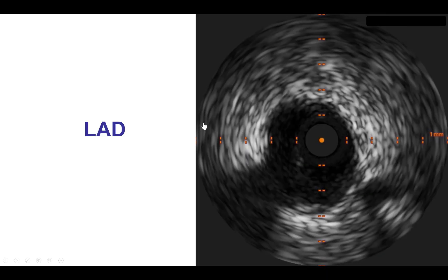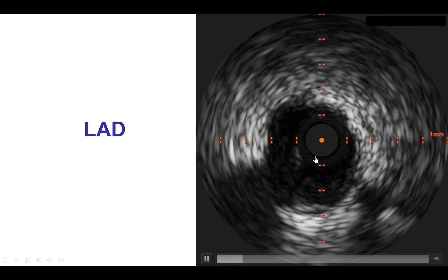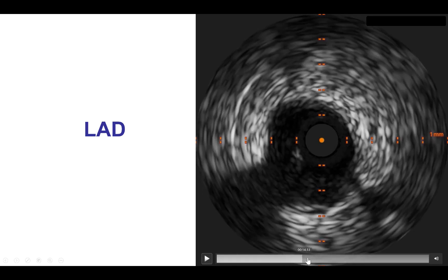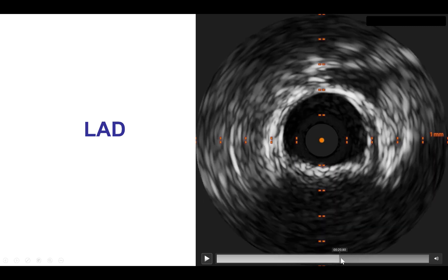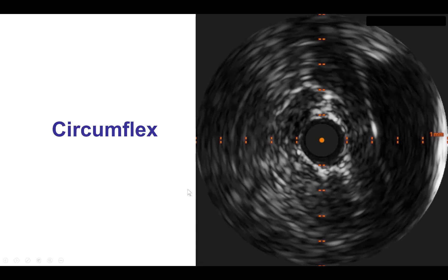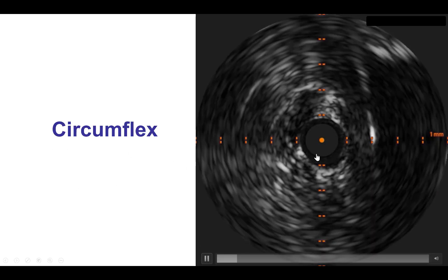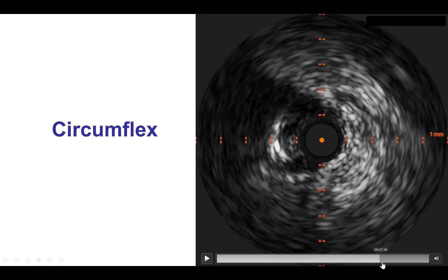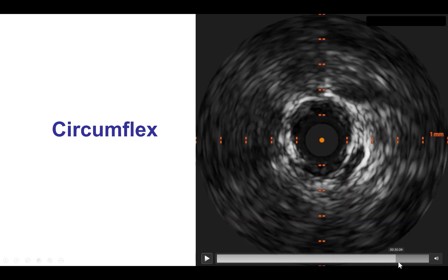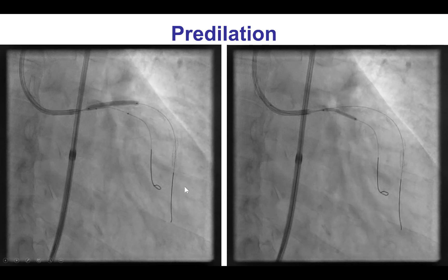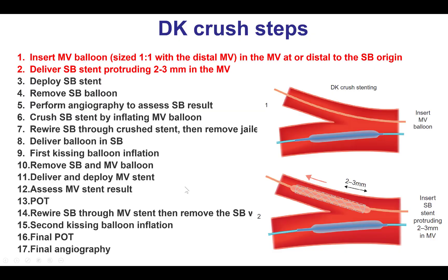The next step is to perform imaging and predilatation. Imaging was done in the LAD, demonstrating calcification, but it was not severe enough to require atherectomy. The vessel was about 3 mm in diameter, and on the left main the vessel was large, about 4 mm in diameter. IVUS was also done into the circumflex, demonstrating very small size — 2 mm distally — but as we moved more proximally the vessel grew to about 2.5 mm. There was some calcium but not severe. Both vessels were predilated, and now we are ready to start with the 17 steps of the double kissing crush technique.